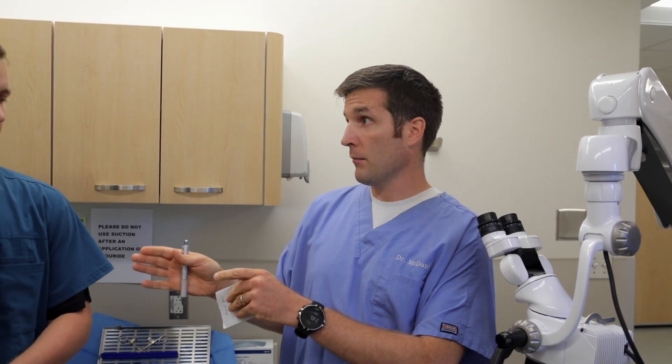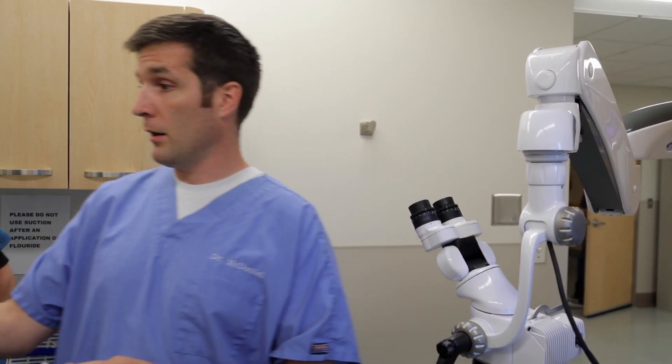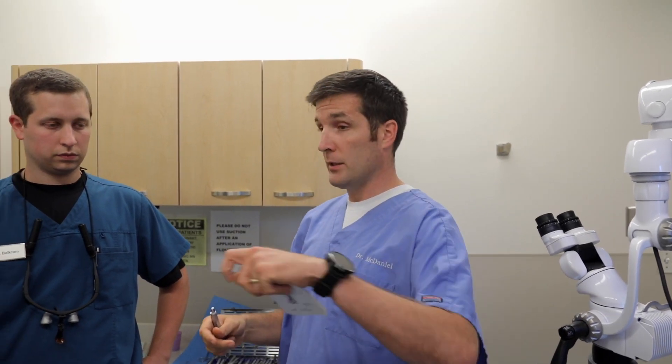Dr. Balkcom, when you can feel the PDL break and you know the extraction is imminent, don't pull the tooth yet — just tell me. When that happens, start mixing MTA. You're going to extract the tooth and rather than placing it on the table, you're going to wrap it in sterile saline and bring it over right here. Then I will pick it up with surgical gloves and use the high speed with the 856-016 burr to do the retro prep. Once the retro prep is done, MTA is placed inside the tooth, and we've rinsed and cleaned it off, I'll place the tooth back into the socket. At that point, the tooth will be splinted. From tooth out to tooth back in, that has to happen in six minutes.